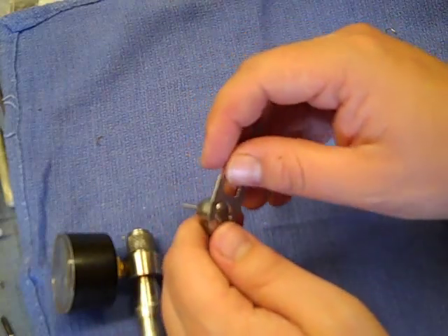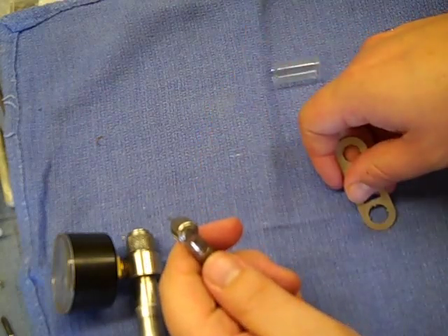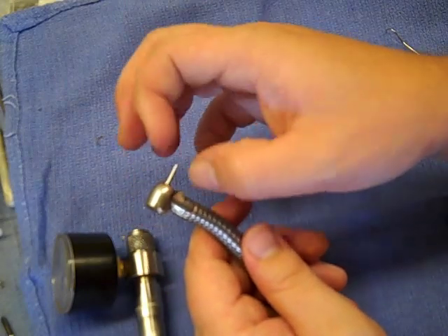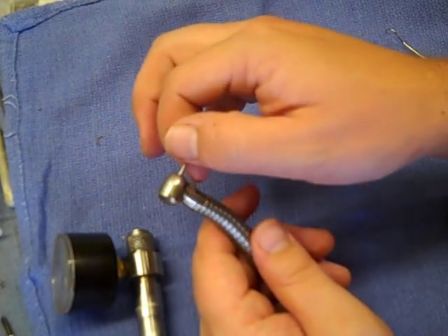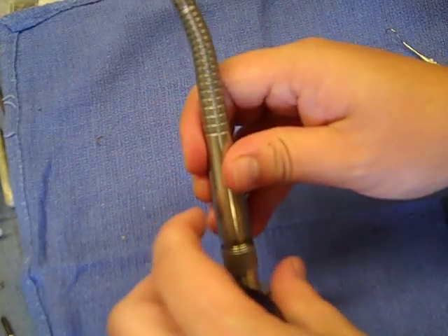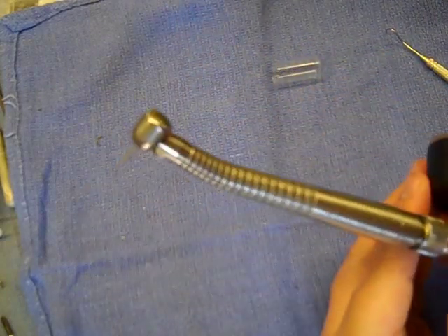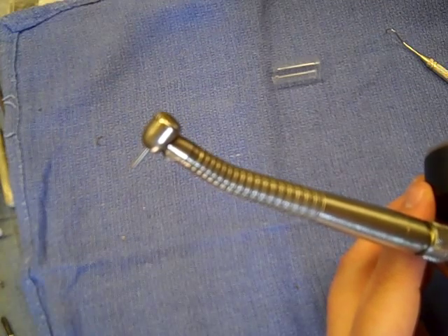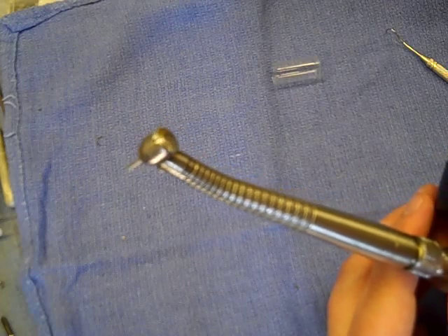Go ahead and snug it down finger tight. Then take your wrench and tighten it just snug — it's not even an eighth of a turn, just a little bit. Take the burr and make sure it spins freely with your fingers with no resistance. If all that checks out, you're ready to hook it up to your coupler. Connect the air line and give it a test run. It should take off like new and sound good.